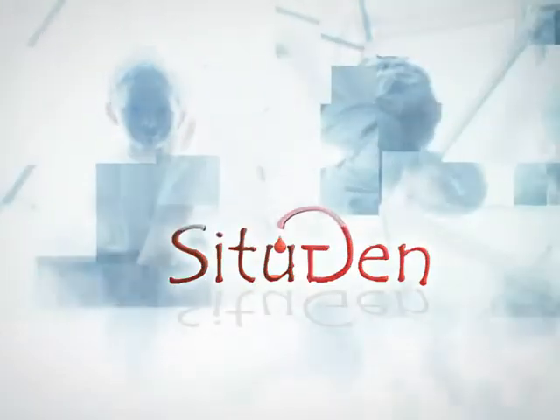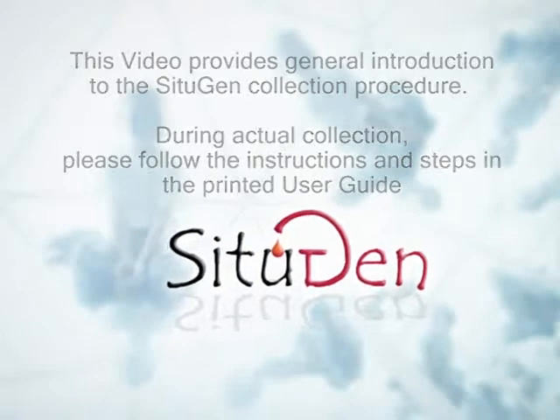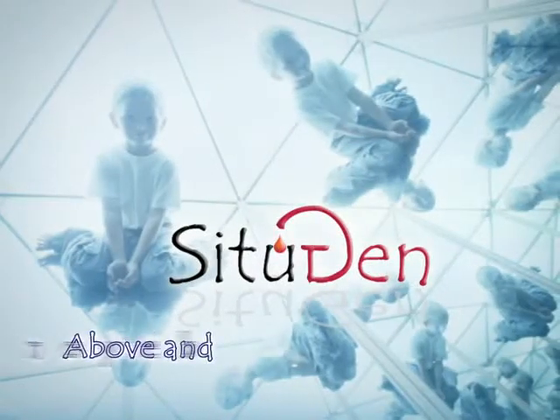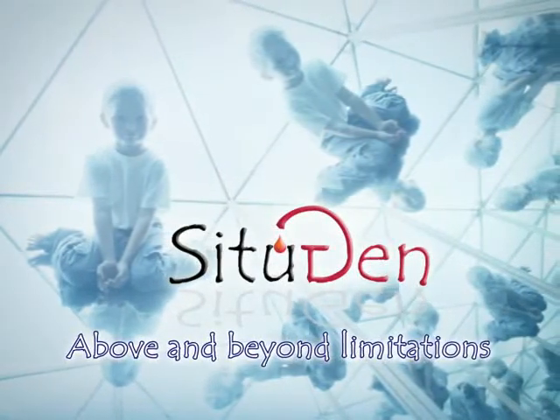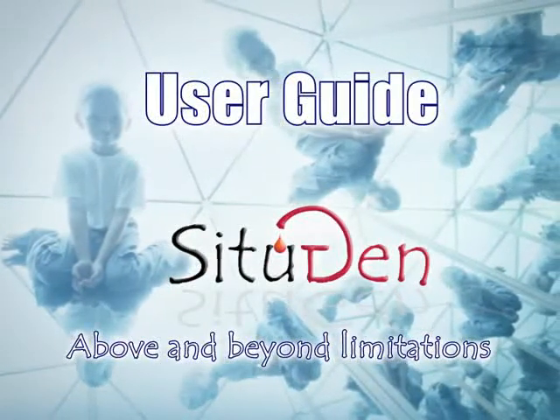CITUGEN — a revolution in cord blood stem cell collection. This video provides a general introduction to the CITUGEN collection procedure. During actual collection, please follow the instructions and steps in the printed user guide. Welcome to the CITUGEN user guide video. Please allow a few minutes for this presentation.